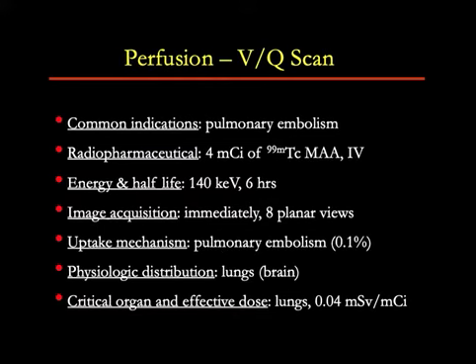After the ventilation study, we do the perfusion study, where patients are injected with 4 millicuries of technetium-99m MAA, or macroaggregated albumin particles, and immediately after injection we acquire planar images of the chest in the same 8 planar projections. The mechanism of uptake is pulmonary embolism. So with these particles we are embolizing 0.1% or 1 in 1,000 pulmonary capillaries. Because it's a very low number of capillaries that are embolized, the embolism using technetium-99m MAA is not hemodynamically significant. Physiologic activity is seen in the lungs, and the critical organs are the lungs as well.